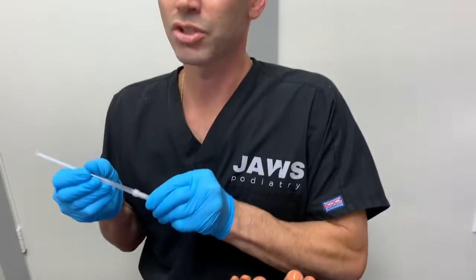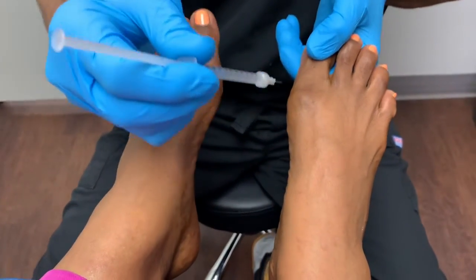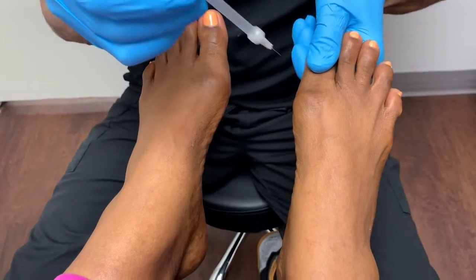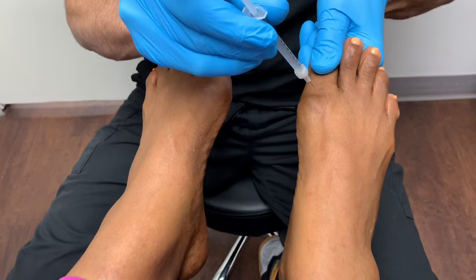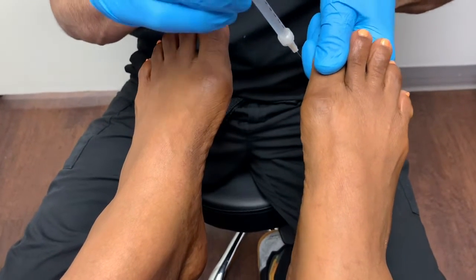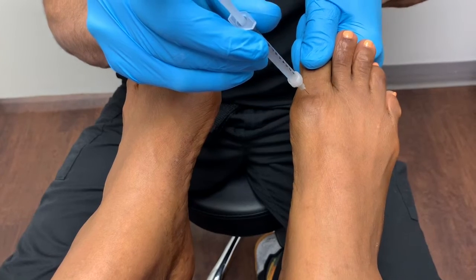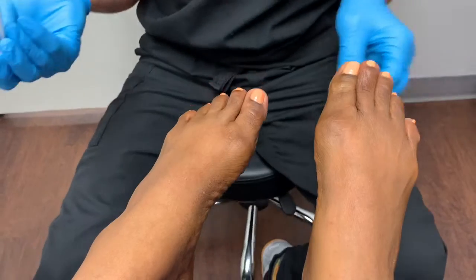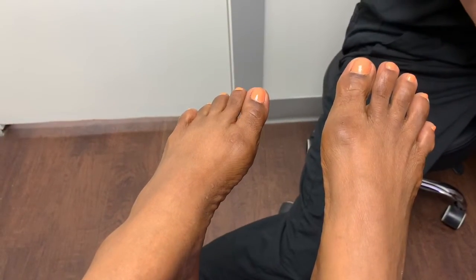I'm not going to use a cold spray. The joint is right here. You can already see the pucker where we marked it. I like to do this motion — and here we go. On a one, on a two, and on a three. Boom. In the joint. And then we're done. That's one, and it took one second.